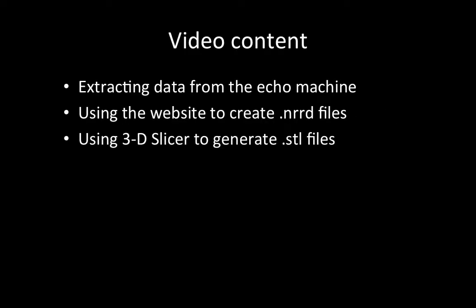The following video is a step-by-step guide for creating STL files from echocardiography datasets suitable for 3D printing. We will discuss how to extract datasets from the ECHO machine, how to use our website to convert those datasets to the .nrrd file type, and finally, how to use 3D Slicer to generate STL files.